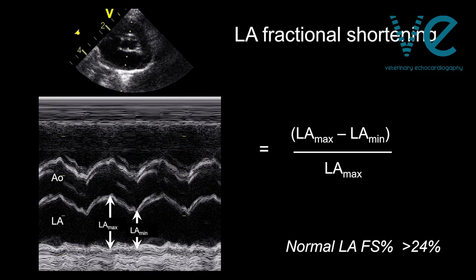The other thing to think about when assessing left atrial size in cats is using M-mode to go through the aorta and left atrium to measure left atrial diameter. Recording an M-mode lets you see the difference between left atrial size at end systole and end diastole. Measuring the percentage change in left atrial diameter with each cardiac cycle gives you an idea of left atrial function. It's quite a straightforward measurement to take left atrial diameter off the M-mode at maximal and minimal diameter, and you get the extra value of an assessment of left atrial function.